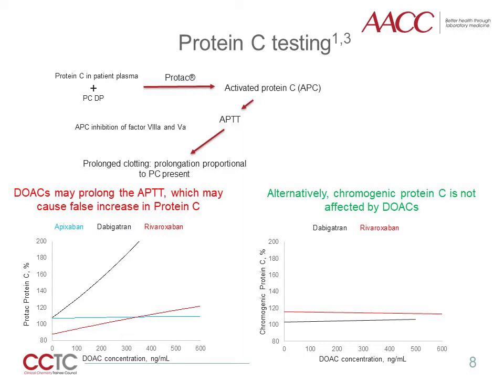While the clot-based protein C assay described here is the most common, there are other reagent platforms using prothrombin time or Russell's Viper Venom time reagents. The DOAC effect on these methods has not been adequately described, but may be vetted with external quality assurance samples provided by CAP or ECAT. Immunologic methods for protein C are not affected by DOAC presence.